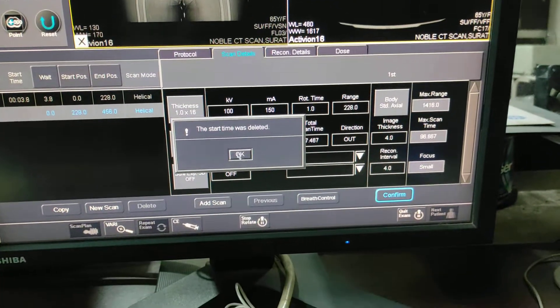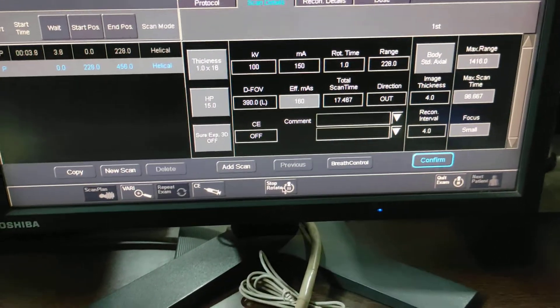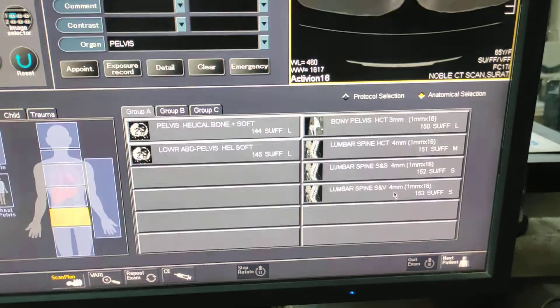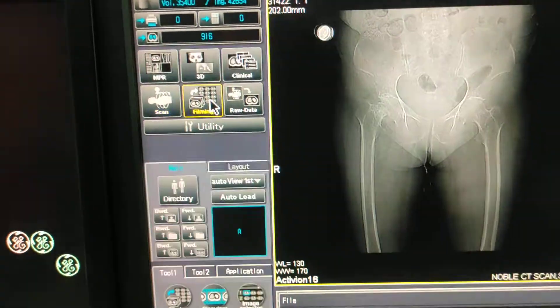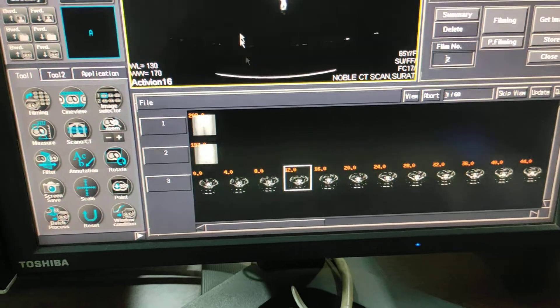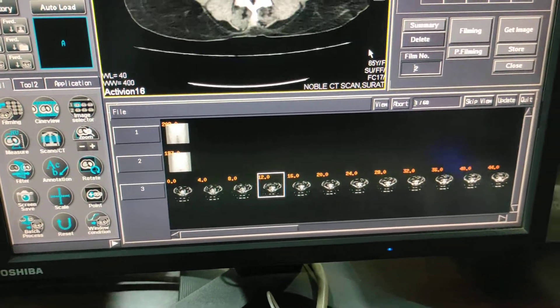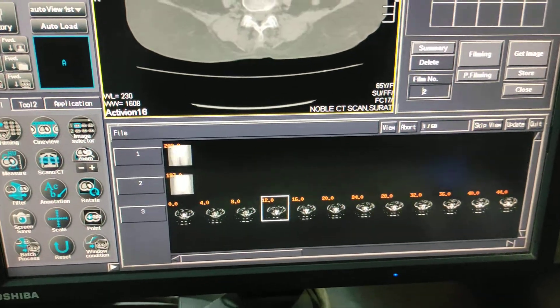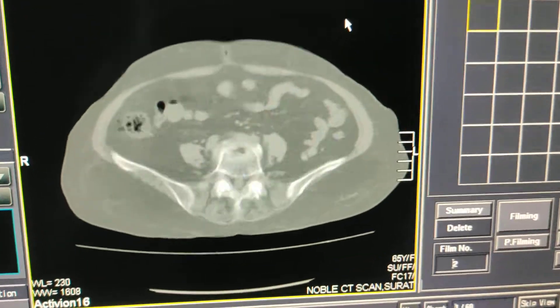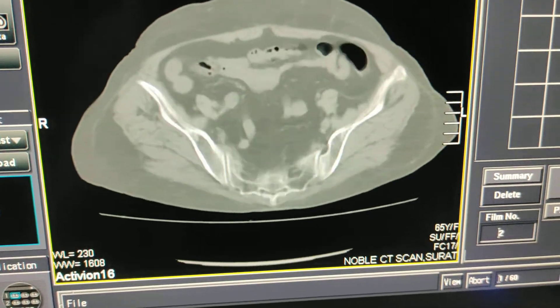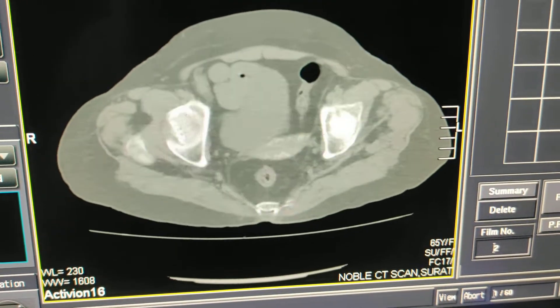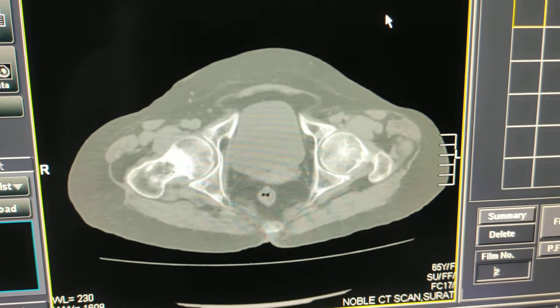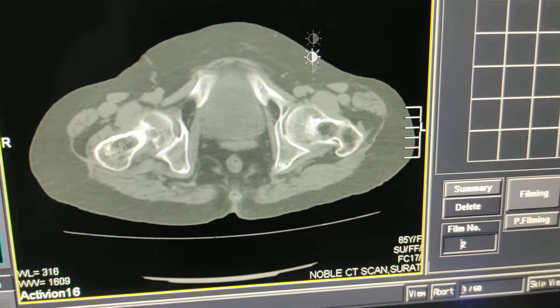After completing the scan, you should always stop rotation and quit the exam. Now I will go into the filming section and check the images before taking the patient out. After getting the reconstructions, I will do proper recons for filming. Here is the fracture in the neck of the femur — on the right side, there is a fracture in the neck of the femur.